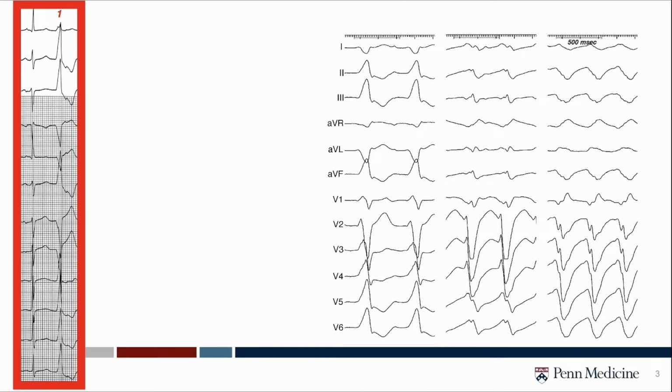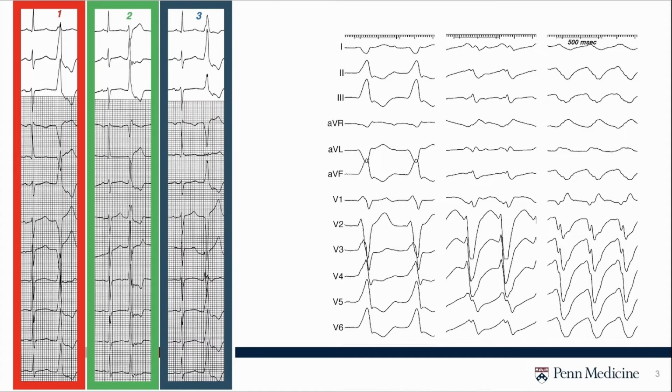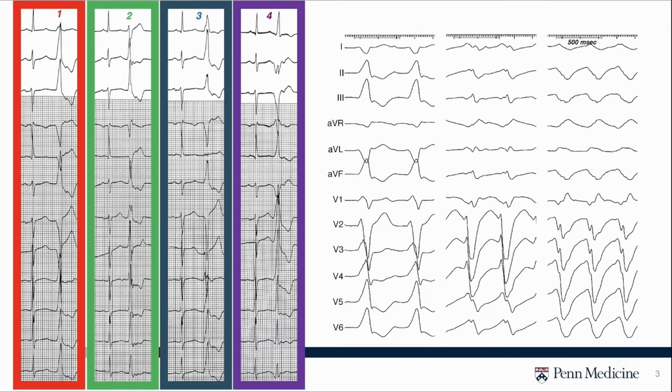This is 2 different patients. On the left, in color squares, is a patient that presented with multiple PVC morphologies. And this is a very classic presentation for a patient with septal substrate. You can see PVC number 1 has a left bundle transition in V3, inferior axis, positive in 1 and more positive in AVR than AVL. This displaces it towards the left ventricular outflow tract and the septal aspect, the level of the right coronary cusp.